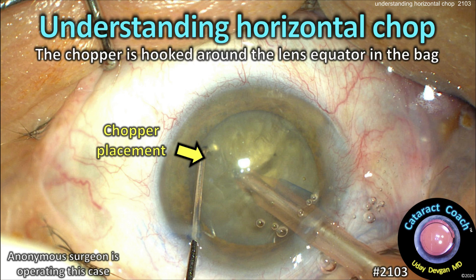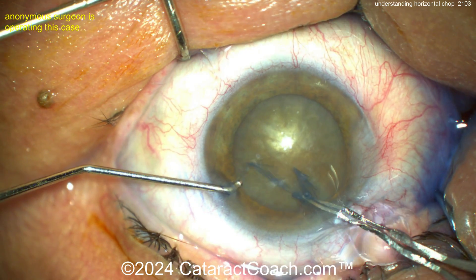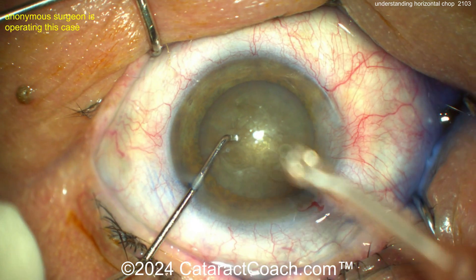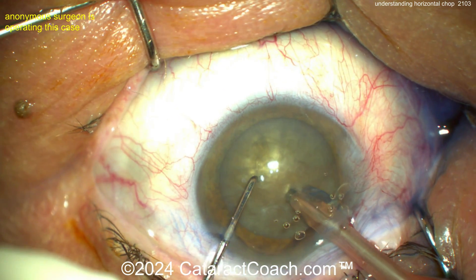cataractcoach.com — understanding horizontal chop. Remember, the chopper is hooked around the lens equator in the capsular bag. Make a good-size rhexis; don't make a baby rhexis, it'll only make horizontal chop tougher. The chopper is going to go under the rhexis and then around the lens equator, so the phaco probe goes into the eye first.